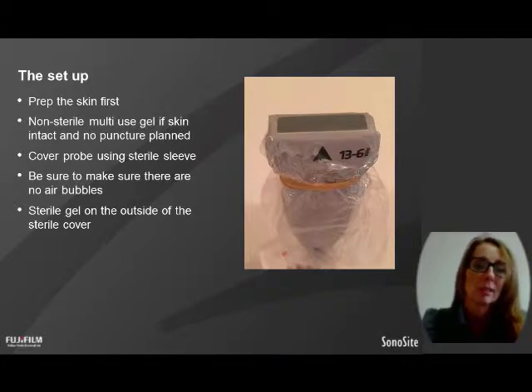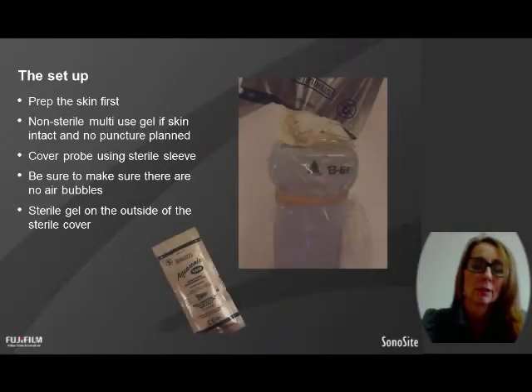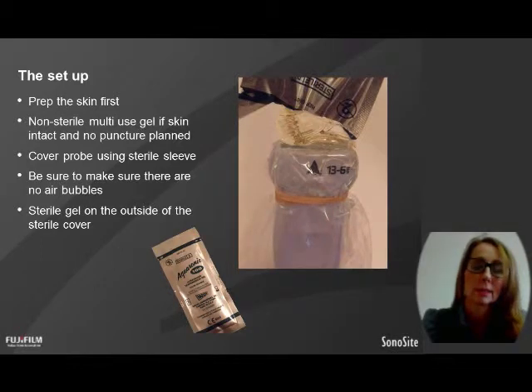Then I put sterile gel on the outside of the sterile cover. There are lots of different sterile gels out there. You can use any gel really. I use a sterile KY jelly that comes in sachets, but it has to be single use and sterile.